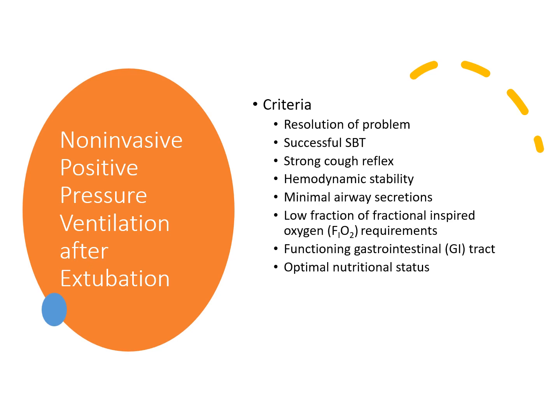It can be beneficial for patients who require some degree of vent support. This will help ease the transition from invasive mechanical ventilation to spontaneous breathing, and usually has a lot of benefits. When we use it for extubation, people are like, what's the point if we're just going to put them on BiPAP? But it's been shown that extubating to BiPAP or extubating to non-invasive improves survival, lowers mortality rate, and reduces the risk of ventilator-associated pneumonia. It's been shown to lower the incidence of septic shock. It shortens the ICU and hospital stays.